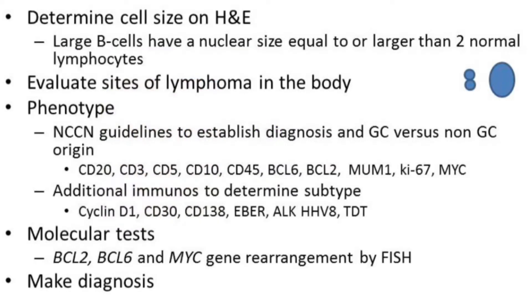The most important point is that we have to determine what the cell size is on H&E. By definition, we say that large B-cells have a nuclear size that is equal to or larger than two normal lymphocytes.